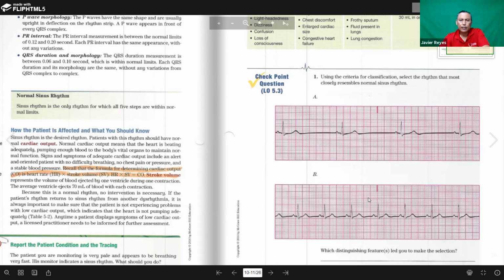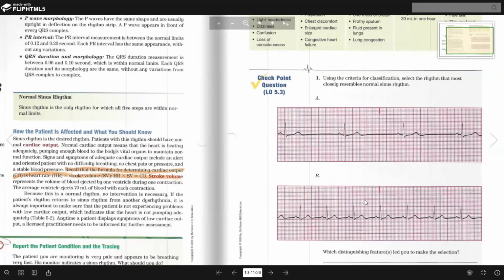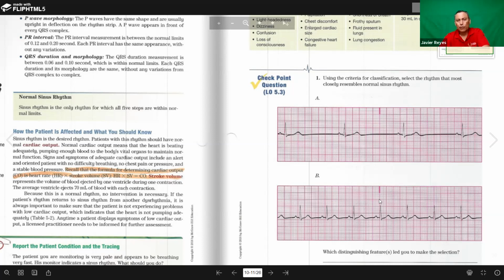Did you already calculate, Jenny? Sure, I was going to ask a question for the 300 method. The boxes have to be complete. Yes, they have to be complete. That's why it's not very accurate. But you can use either of those two with regular rhythms. Now, if we have an irregular rhythm, then we cannot. If these R's don't match, they don't match like this.